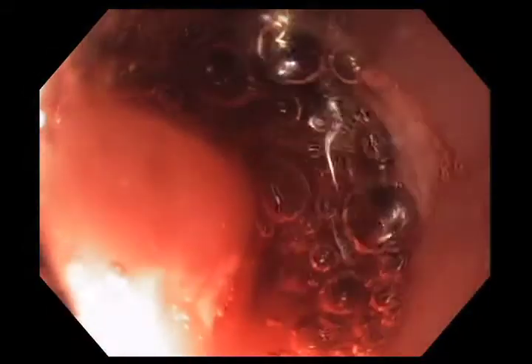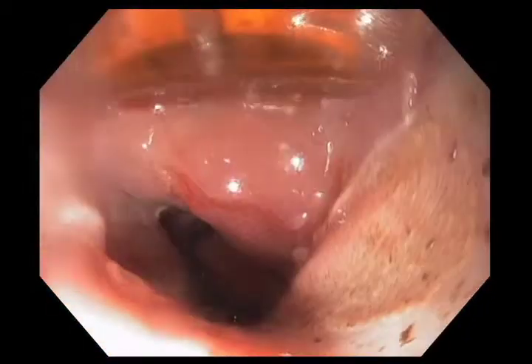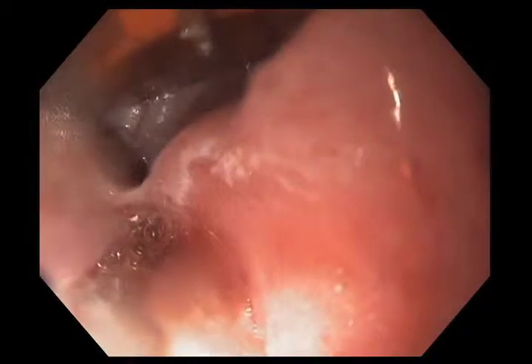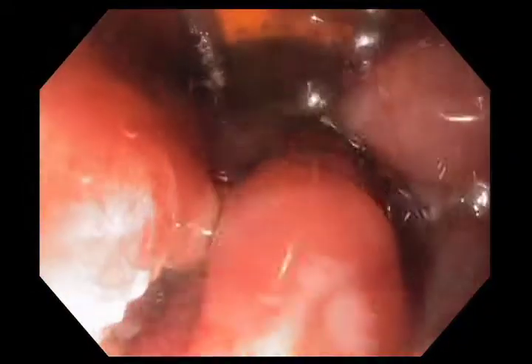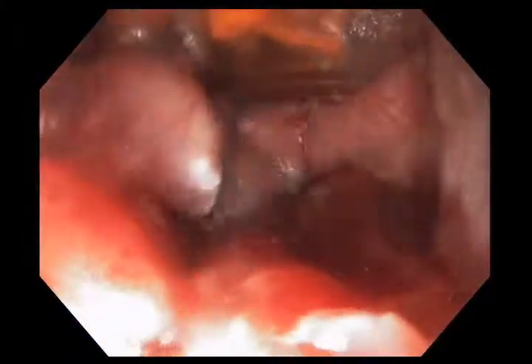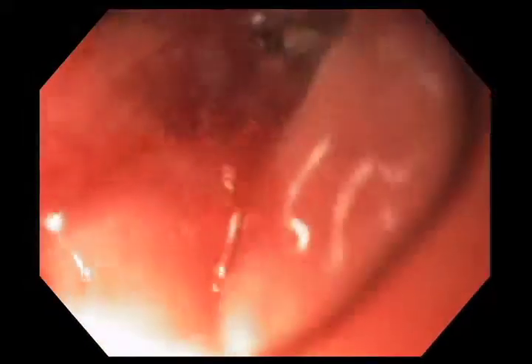Now we're going to retreat this area. Using white light, I'm positioning the device up against the mucosa. There I've done an ablation. Now I'm going to torque to the left to get that island again, position it at 12 o'clock, come up on my up-down, and when I feel I have good pressure and contact, I push the pedal. This second treatment is more difficult to appreciate — once you've done the first layer, it's harder to see where you've been and to see the second treatment, so a little bit of it is empiric. I look around and perceive where I need to treat. I'm going around that GE junction again, all 360 degrees, to get those tongues of Barrett's that were present.